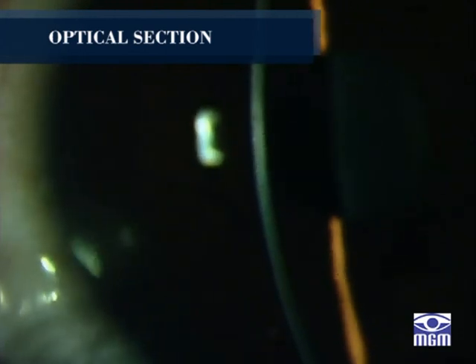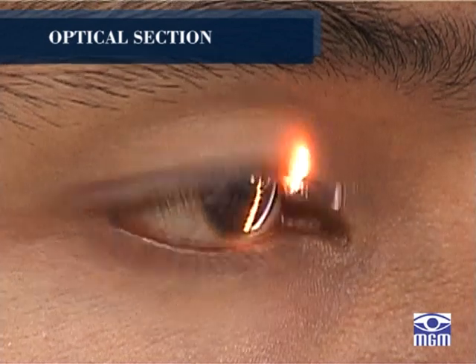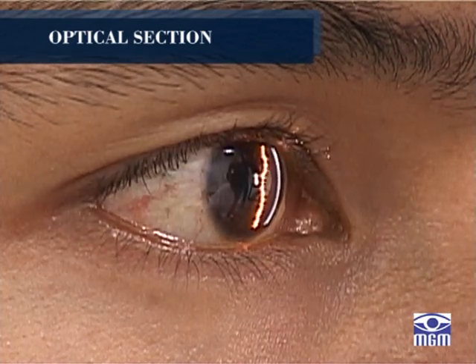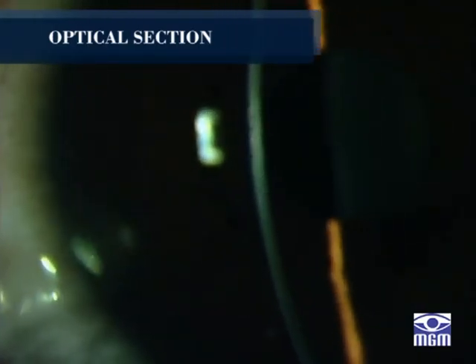In optical section, the slit beam is the narrowest, and a fine blade of light makes possible the virtual serial sectioning of transparent tissues in the living eye. Here, the light slices are presented tangentially, and this facilitates a cross-sectional view of the cornea and lens.